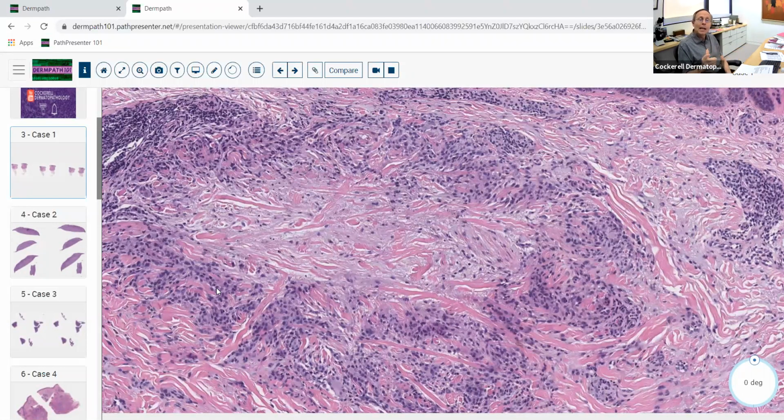It's really a neoplasm where you get central tumor necrosis and you get a palisade of actually neoplastic cells that are highlighted both with cytokeratin and with vimentin. And then there are the granuloma annulare-like eruptions that occur in patients that have connective tissue disease, so-called interstitial palisaded granulomatous dermatitis. Those usually don't have as much mucin, but they can have some mucin, and they also can sometimes have some neutrophils in there.